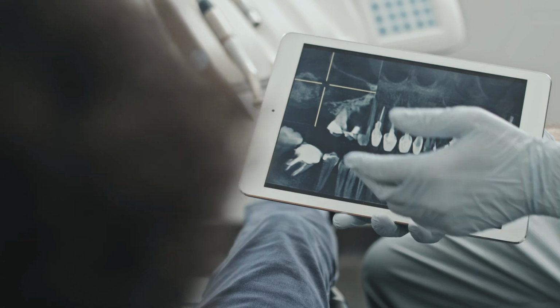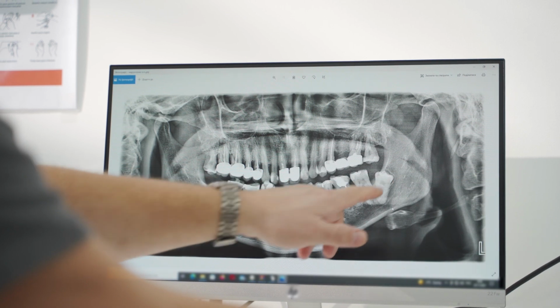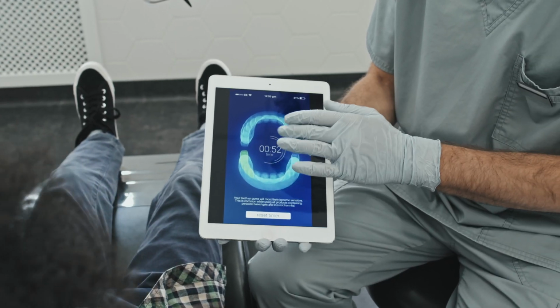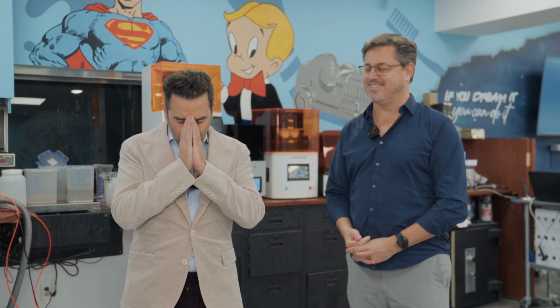And you know, when we do these cases, we put so much into it. People don't realize, they do the surgery, they get the patient numb, they take out the teeth, they place the implants, they do the bone graft, they take the photogrammetry or intraoral scan, they import it into exocad, they design everything in exocad, and then the last thing they do is they nest it and they wait patiently saying, oh my God, I hope it works. And more importantly, is it gonna print?